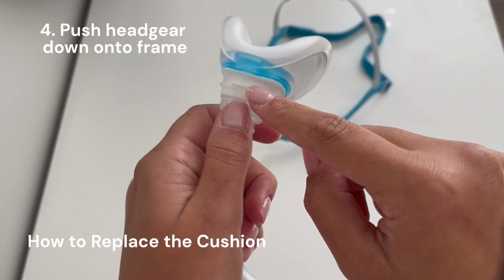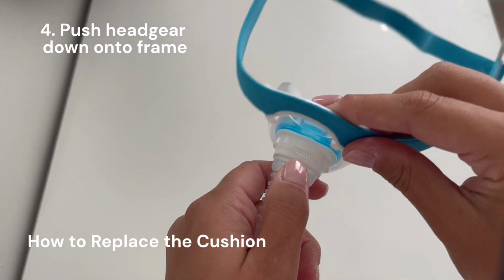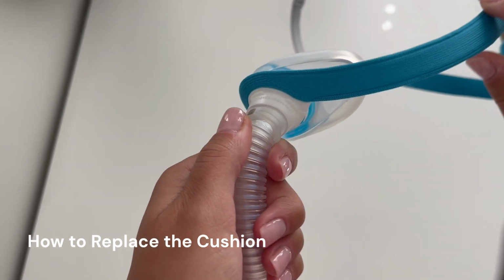Push the headgear down onto the frame. To make it easier, use where they clip onto as a guide. You will also hear a click letting you know that your mask is connected and secure.